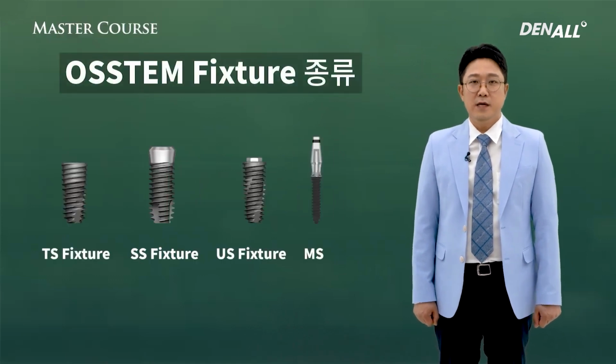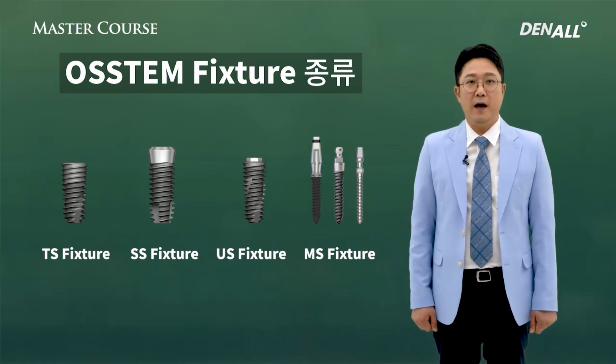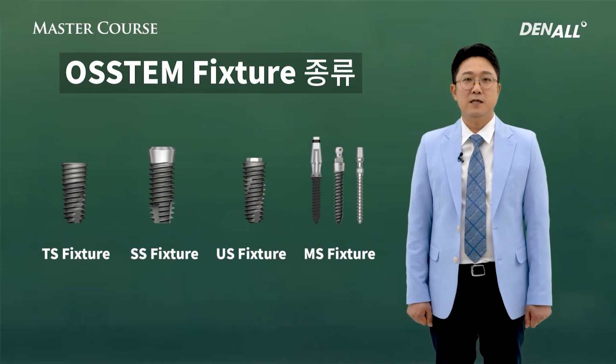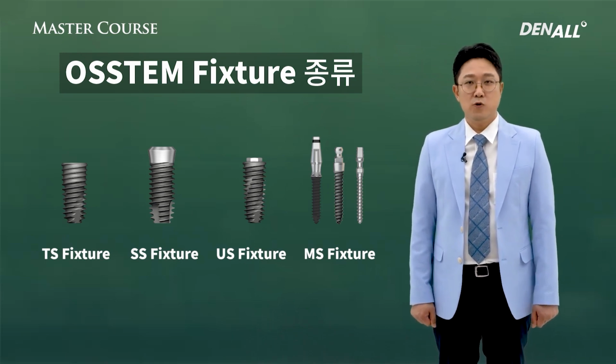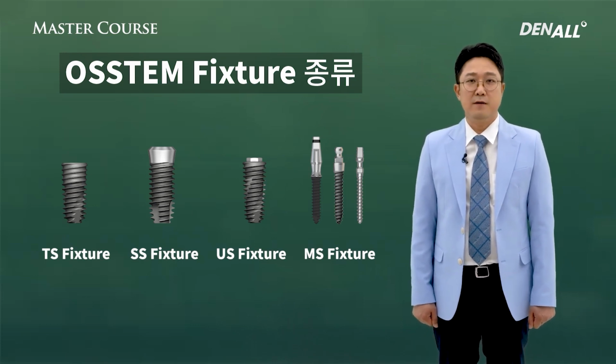Recently used fixture forms can be largely divided into 4 like this. Details will be addressed in Lecture 3 and Lecture 4. Today, I'm going to talk about the overview in detail.